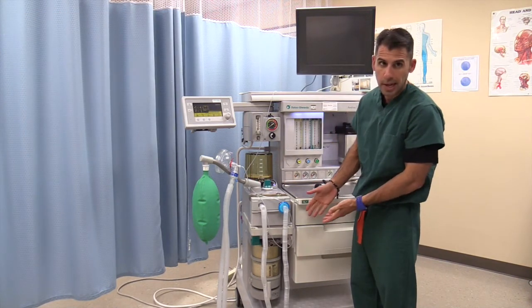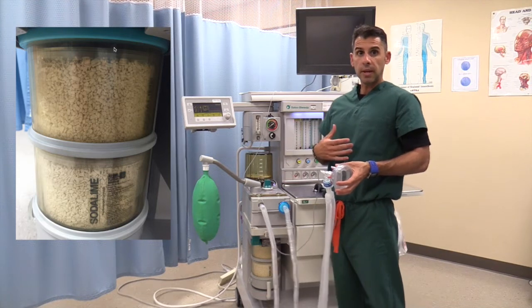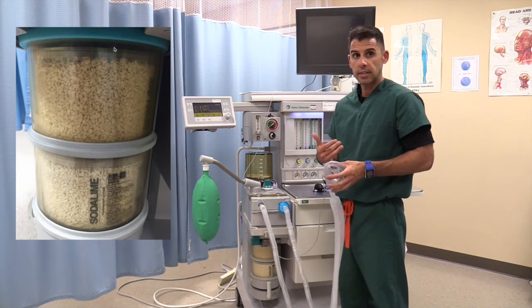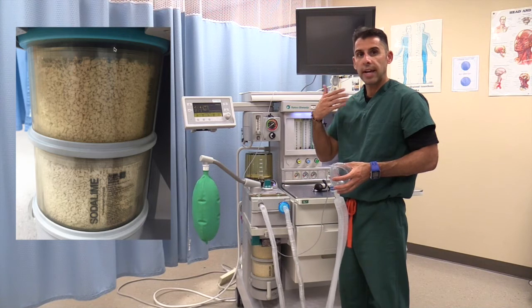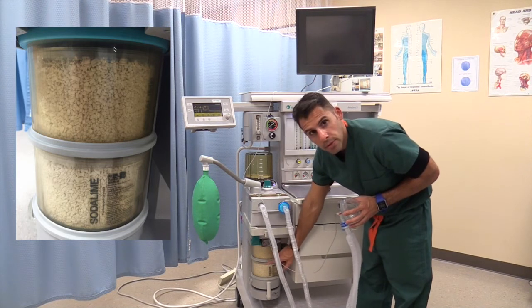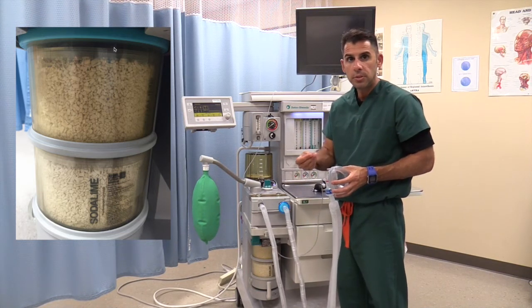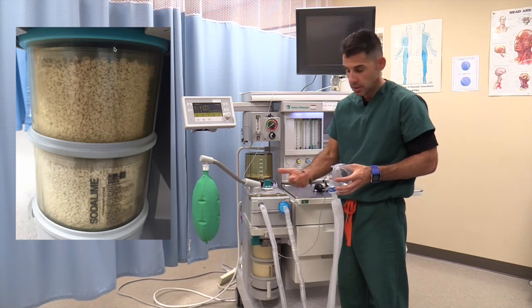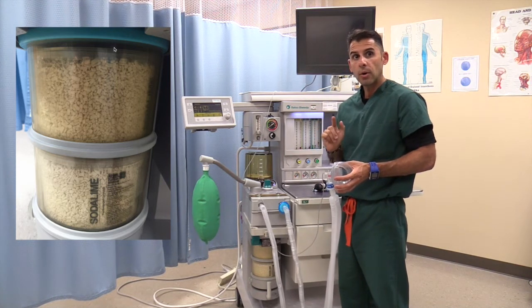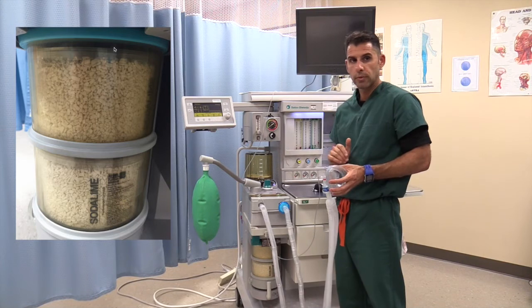The sodalime system works as follows: when hooked up to the anesthesia machine, you breathe in oxygen and anesthetic gas. As you breathe out, you breathe out anesthetic gases and CO2. The CO2 gets recirculated and filtered through the sodalime. The sodalime has a special dye indicator that turns purple when it has been used up and can no longer function as a filtration system — at that point you must change it. The anesthetic gas that gets filtered out also goes through the scavenging system, which is in the back of the anesthesia machine.